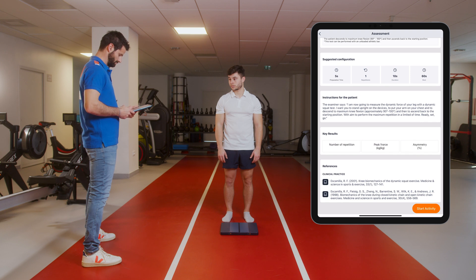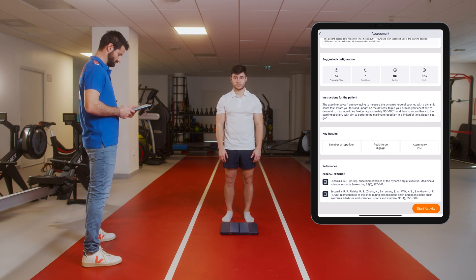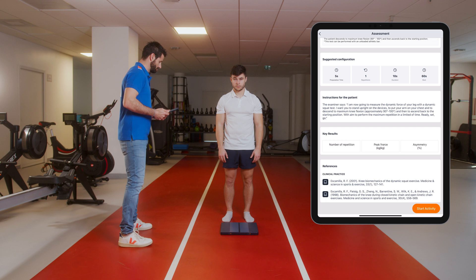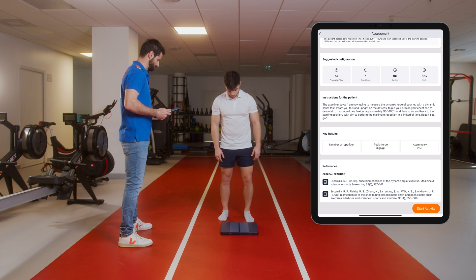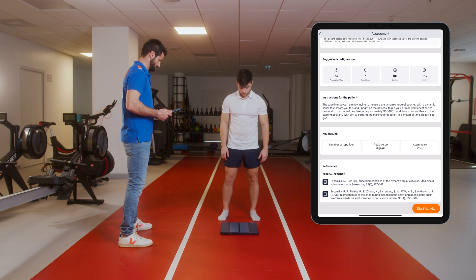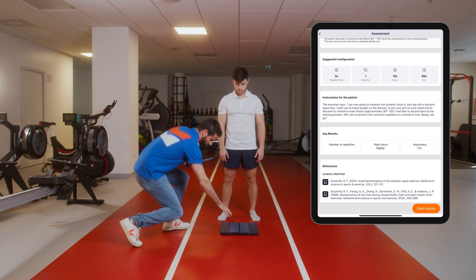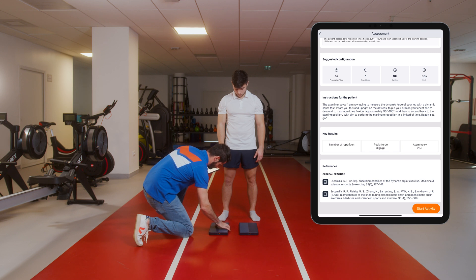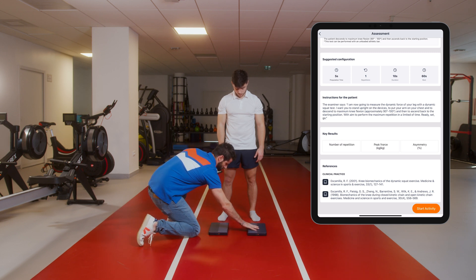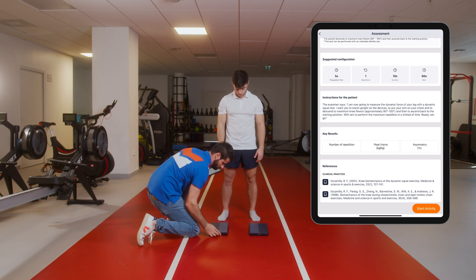A description of the test will be displayed, along with the goals of the test, the equipment you will need, and how to explain this exercise to your patient. You will also find the pre-programmed sequence, the key results that will be produced, and some scientific studies.